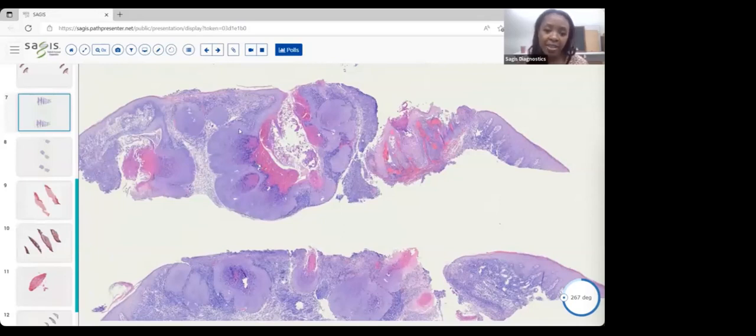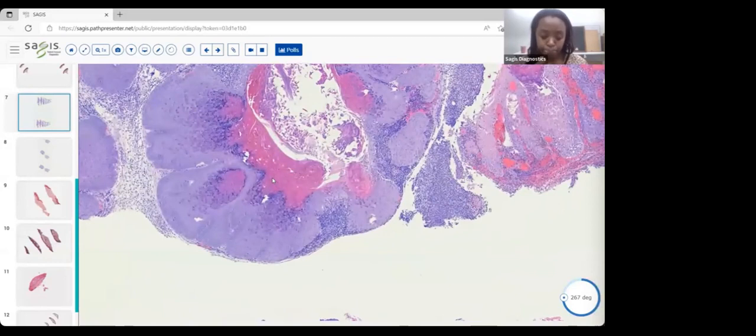When we start seeing this kind of pattern, this lobulation, there may be some inflammation, but the pseudoepitheliomatous pattern, which is something worth thinking about if you don't have a clear diagnosis. It could certainly be a regressing lesion of molluscum.